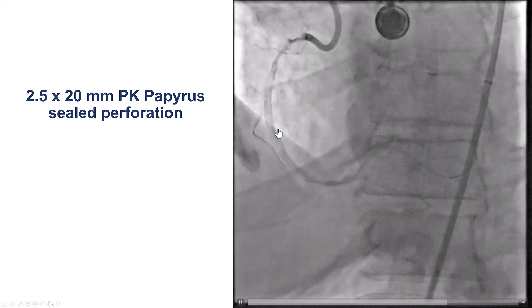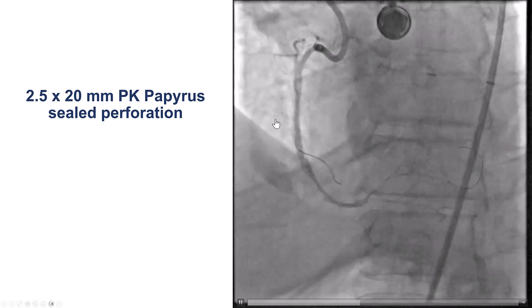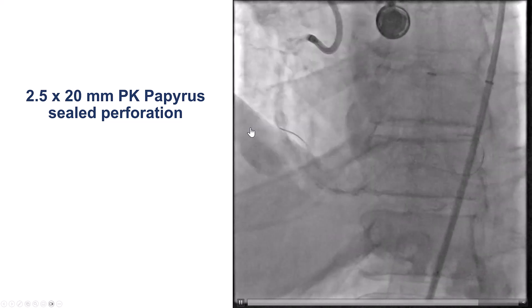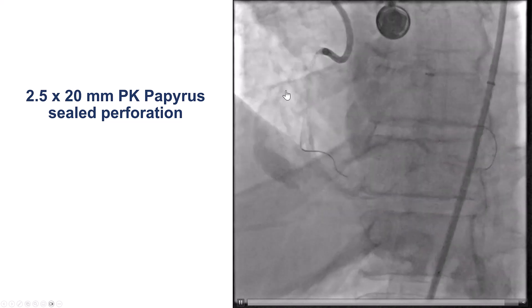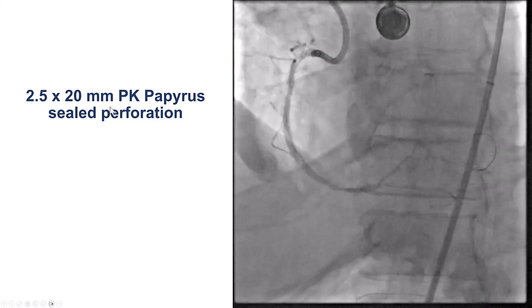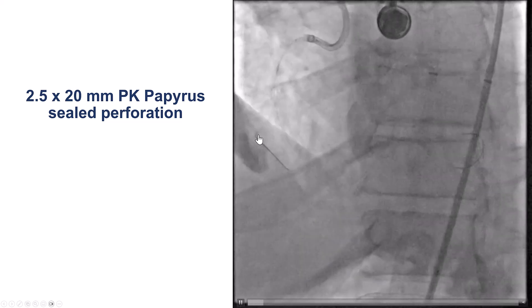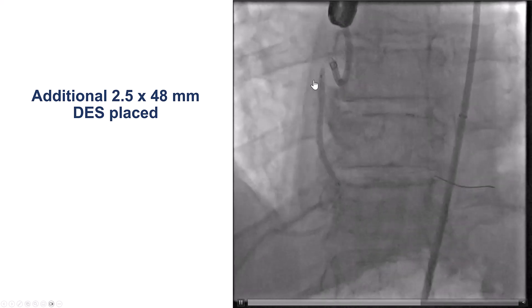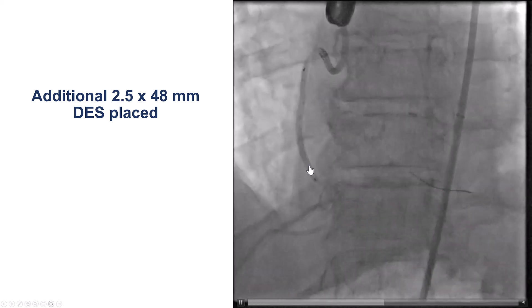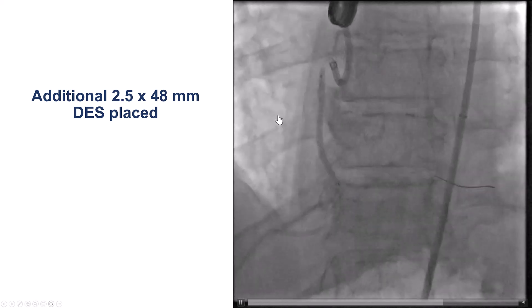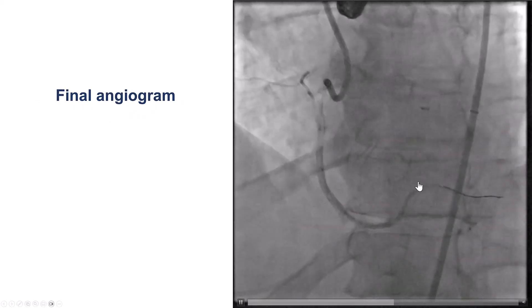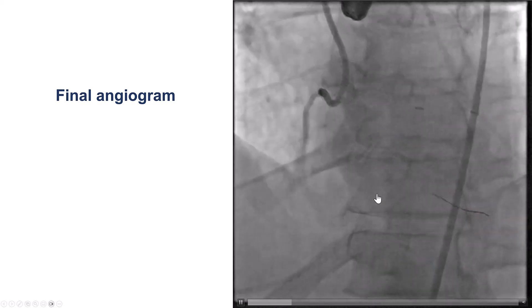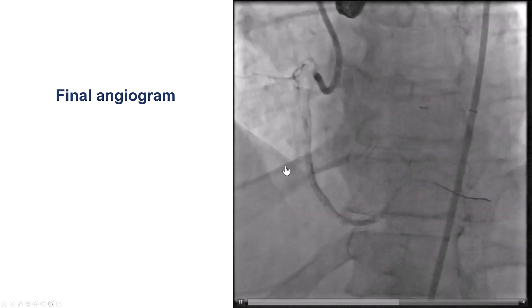We decided to put a covered stent. Although the perforation was in the side branch and often we can coil those branches, we thought that this branch was fairly disrupted. So we decided to cover the whole side branch by using a covered stent — a PK Papyrus stent — which successfully treated the perforation. We also placed a drug-eluting stent, both to cover the areas proximal and distal, and also to potentially decrease the risk of restenosis. This was the final result — not perfect, but we do have TIMI flow into the right coronary artery, and the perforation was sealed.